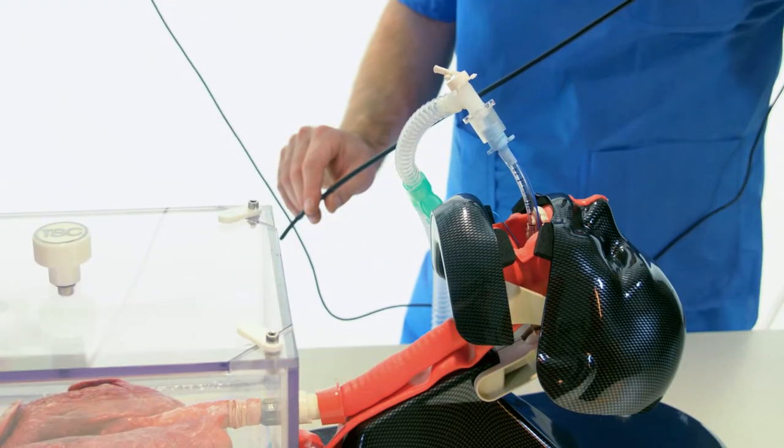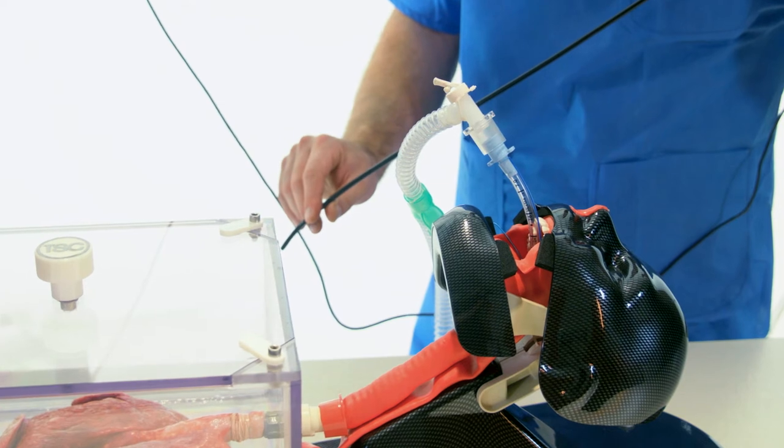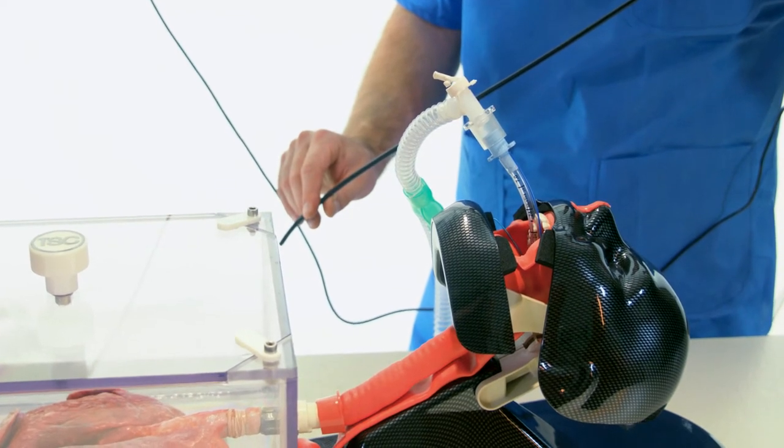A bronchial wash is often performed on sedated and ventilated patients in the intensive care or in the bronchoscopy suite.